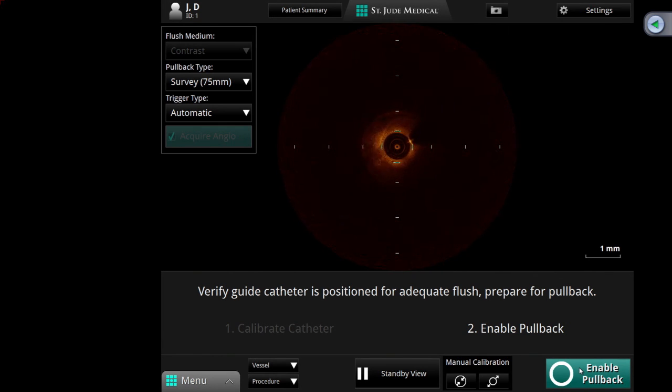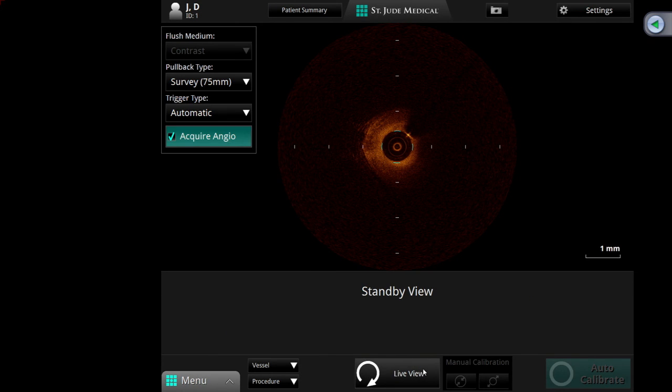Why did nobody connect that? Give me. It's connected? No, give me. We need a big syringe. No, stop that. Where is the connection? Okay, here. What is all this now? Only this one? What is it?